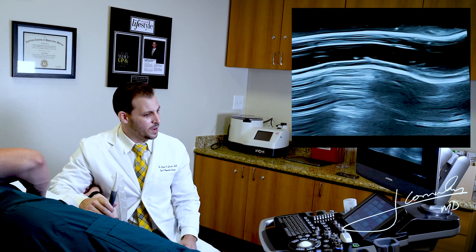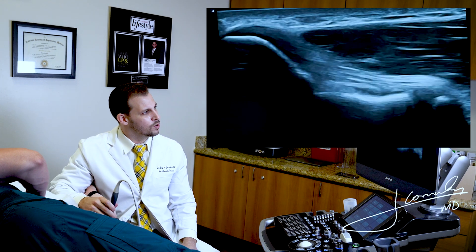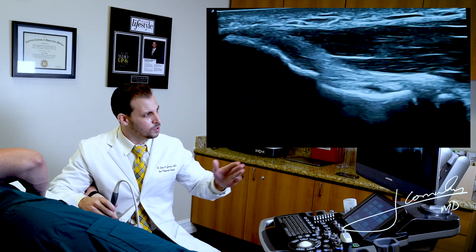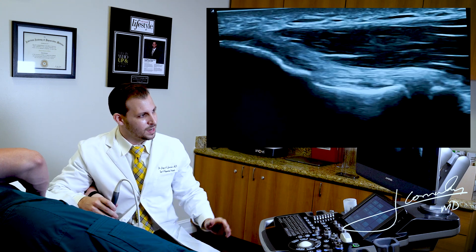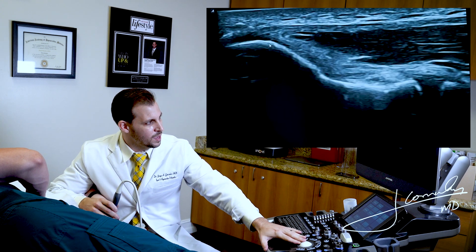The first thing that we want to find is the medial epicondyle, which is going to be the bony contour. In this image, I'm going to find my medial epicondyle on the left side of the screen. So proximal is going to be on the left side and distal is going to be on the right side. The first thing we want to find is the bony contour of the medial epicondyle right here.